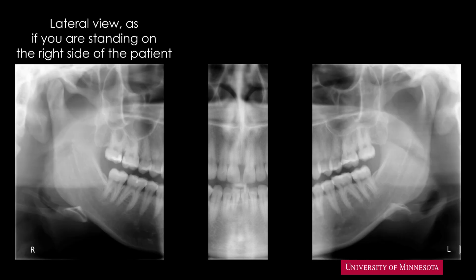A rather simple way of reviewing a panoramic radiograph is to consider this one image as three images stitched together. Mentally split the panoramic radiograph into three parts as we see here. Consider the right posterior area as a lateral radiographic view, as if you are standing on the right side of the patient. This is a simple explanation of a quite complex radiographic projection.